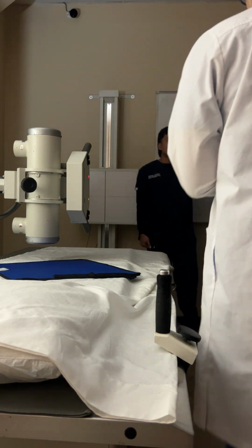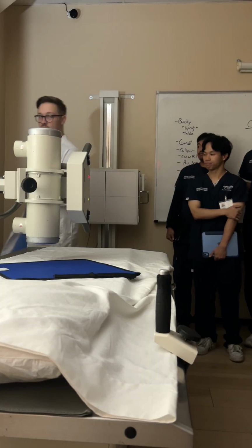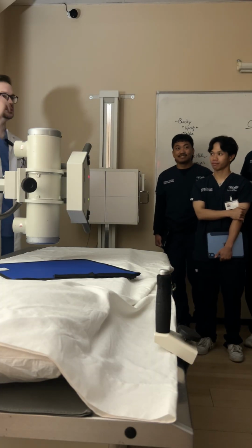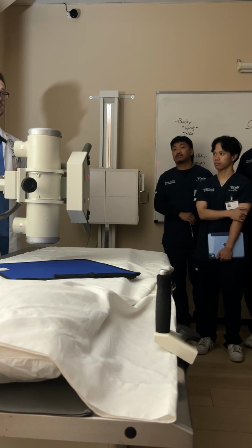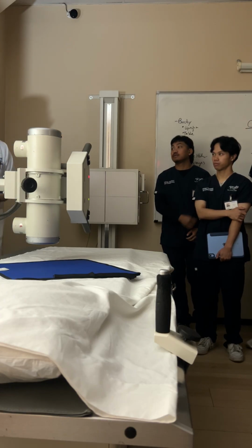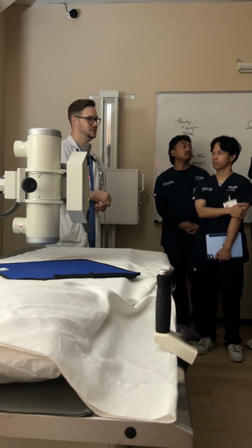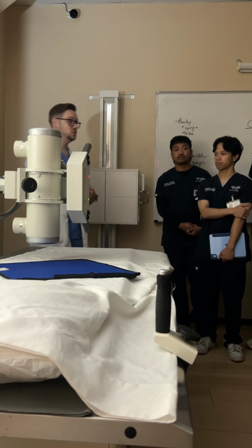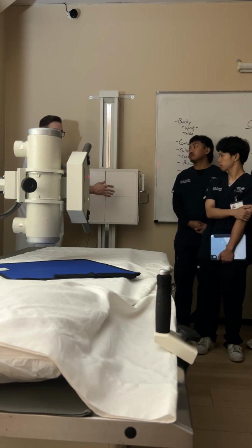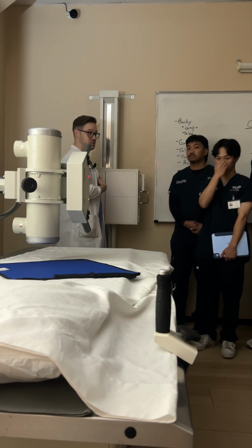All right. What is the SID for a PA or AP chest? 72. What is the SID for a lateral chest? 72. Why do we do preferably a PA chest and a left lateral chest? Trick question! The heart. Absolutely. The heart is more anterior in the chest, right? So we do it PA so we can reduce the OID of the heart. We do a left lateral for the same reason. The heart is more on the left side. We get it as close to the bucky as we can, okay?